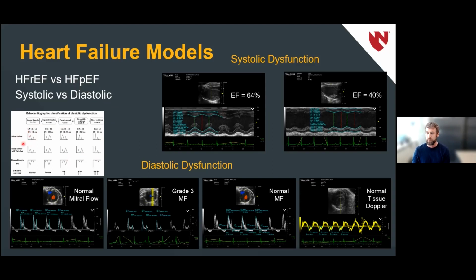To measure diastolic dysfunction, we use an apical 4-chamber view where we take the transducer and point through the apex of the heart up towards the mitral valve. In a normal animal, we'll see this nice E peak and A peak. The E is the passive filling, the relaxation of the ventricle, and the A is the atrial component when the atria contracts to fill the heart. In a normal animal, this ratio of the E to A peak is about 1.5, as seen in the normal images here. So that's the E peak and the A peak, and the ratio calculated is about 1.5.